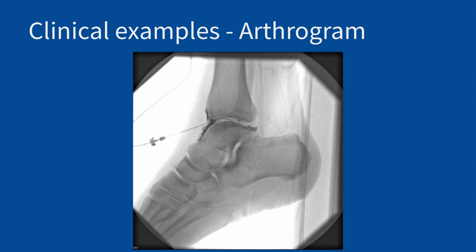But essentially, you go into the joint, you can verify that you are in the joint space, and then you can actually see how that fluid distributes throughout the joint.